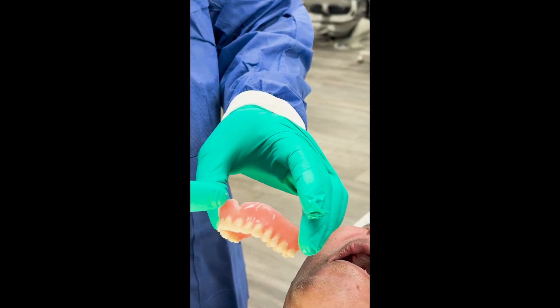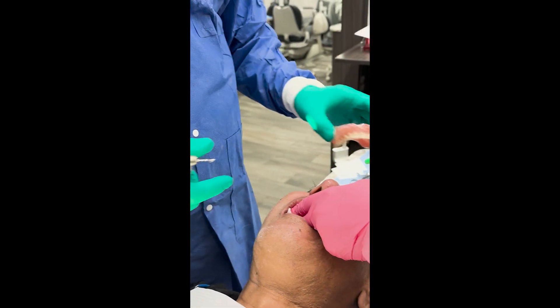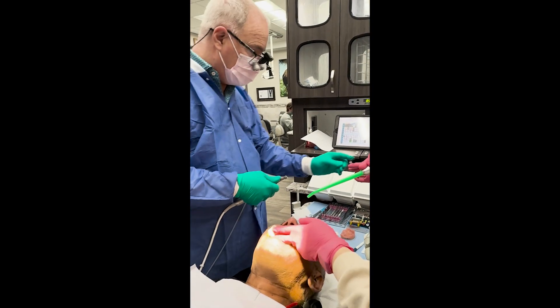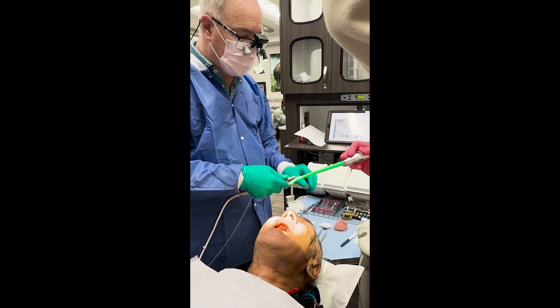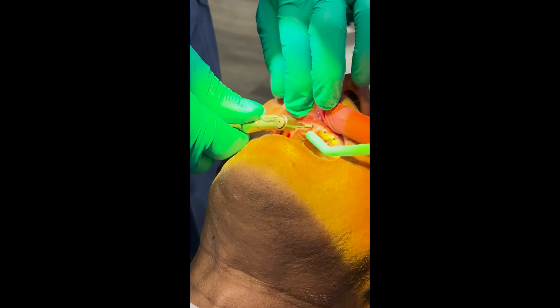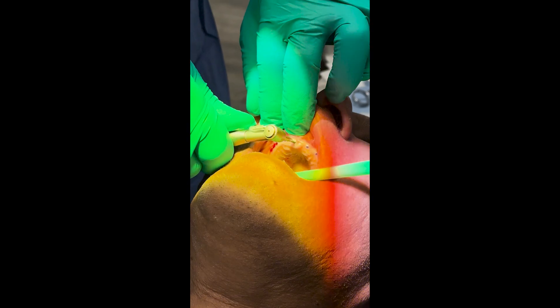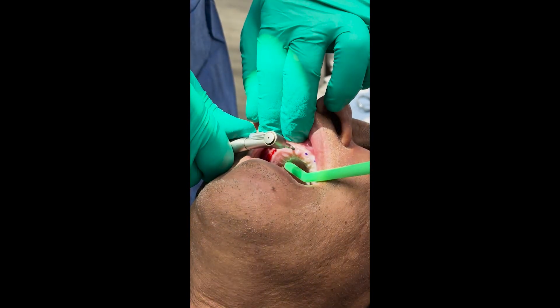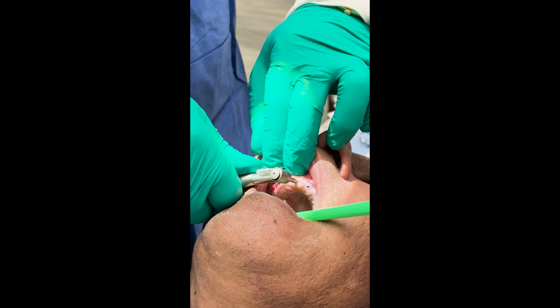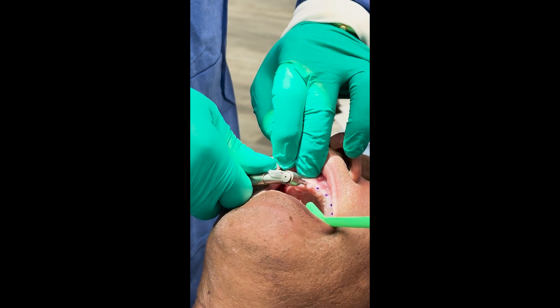You can see he had quite a bit of flange on his denture, so we don't need to give him that much, but we definitely need to give him some lip support. We place five holes and we're going to start with our most anterior. We want to reach 30 newton centimeters of torque if at all possible. We got beeping at 30 newton centimeters — we bury that implant down all the way to the collar. We're going to go to 60 and bury it down a little more.